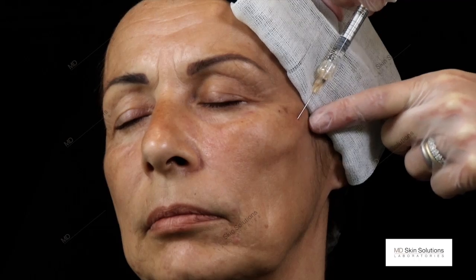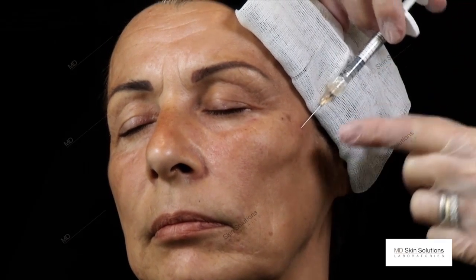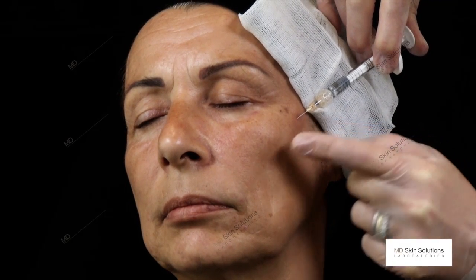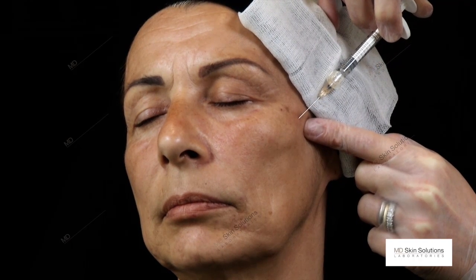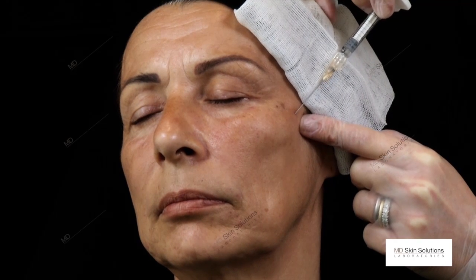This volumizing filler is a very precise one. See how it does a nice definition of the injected area. And now I go do a second pass, advance, kind of control the tip, and I withdraw. And I do inject the filler in a retrograde fashion, and I do stop before I go out.